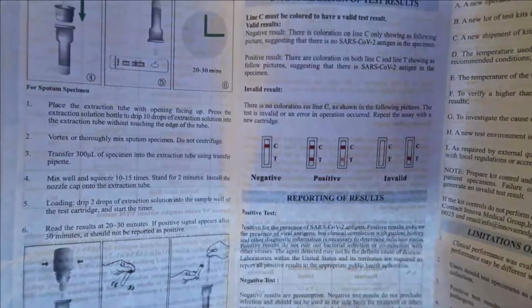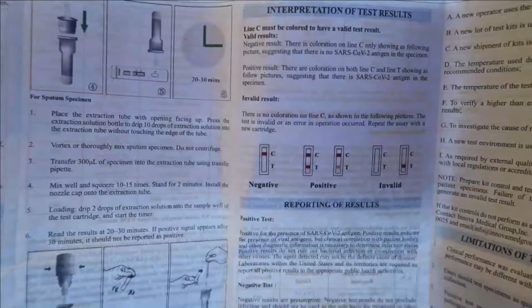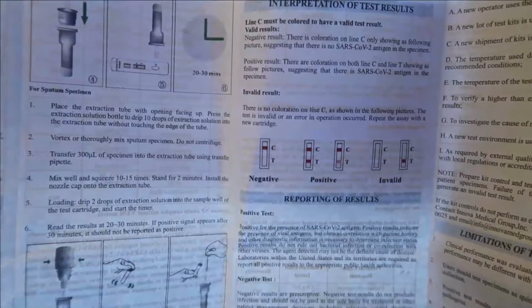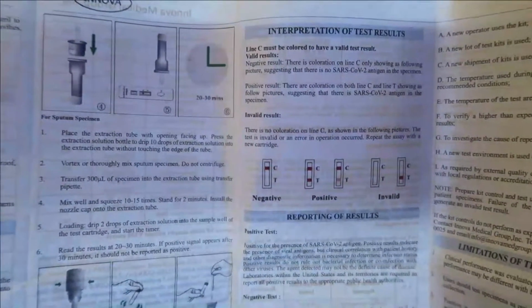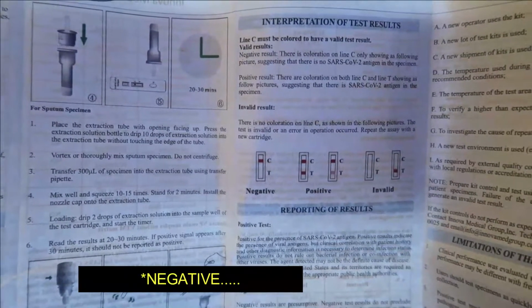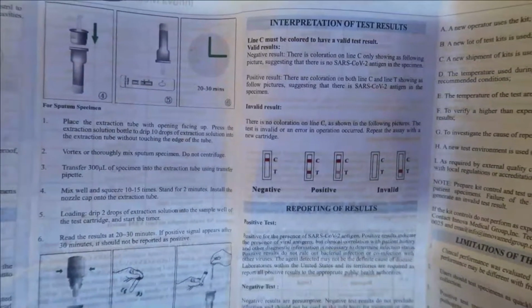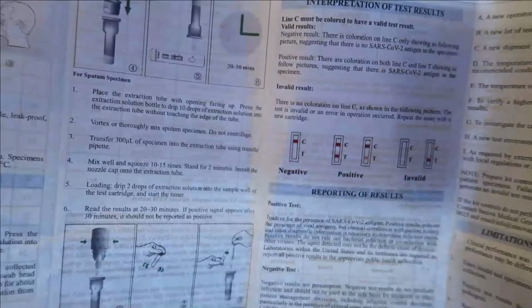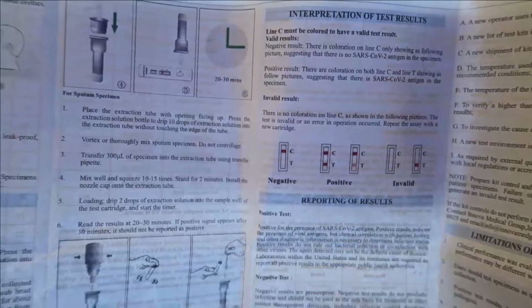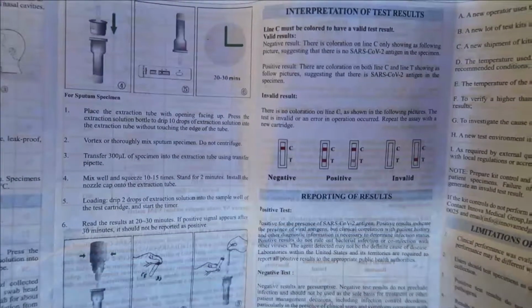So a positive test for the presence of SARS-CoV-2 antigen indicates the presence of viral antigens. Negative test results are presumptive, and negative results do not preclude infection and should not be used as the sole basis for treatment or other patient management decisions. So on our website, they also stipulated that even though you test positive in your home test kit, or you feel like you're not really feeling well, you can still ask for a swab test, and they have provided the phone numbers to contact in our COVID hotlines in the hospital. You can always ask for advice, and most probably they will do the swab for you.